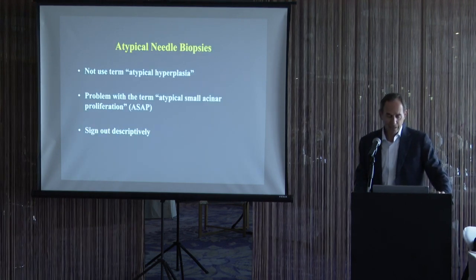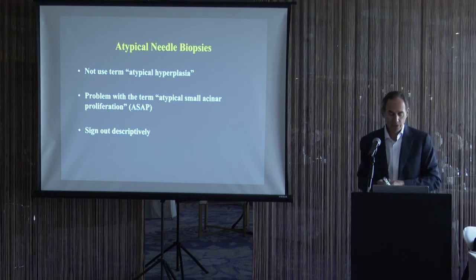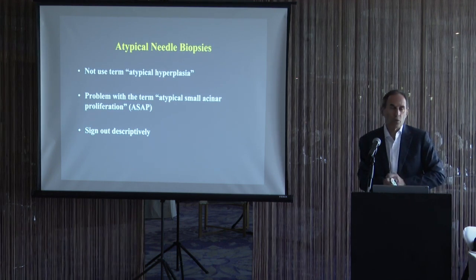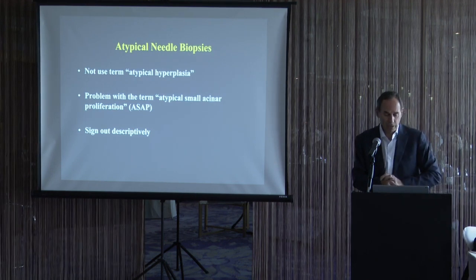So let me end this talk with discussing atypical needle biopsies. So first of all, I don't use the term atypical hyperplasia. It's a very non-specific term. A clinician won't know what you're referring to. It could be PIN, could be intraductal cancer. They don't know what that means.